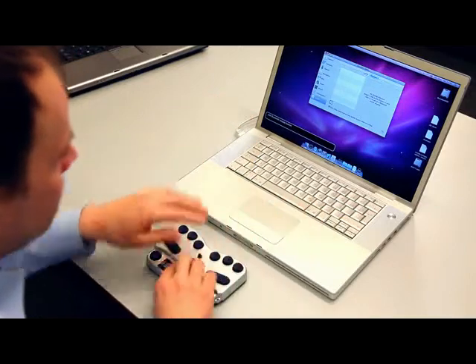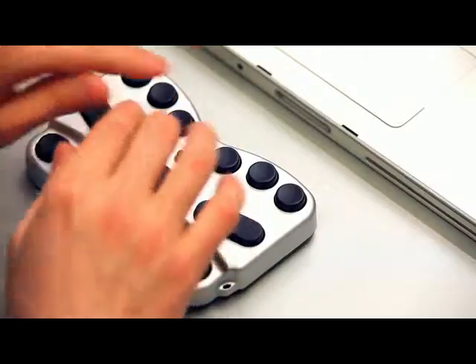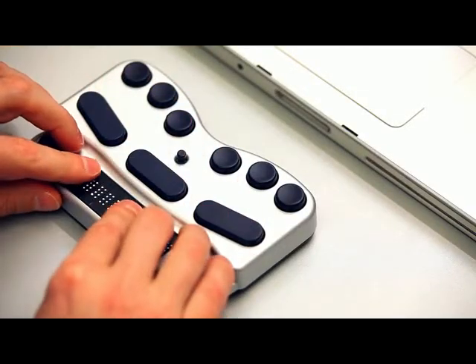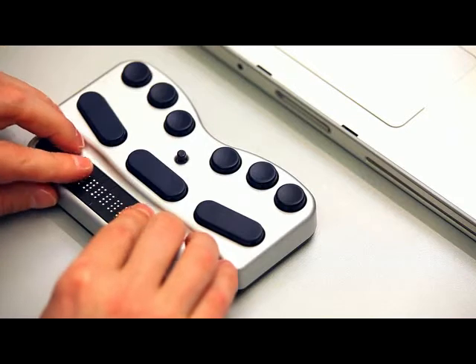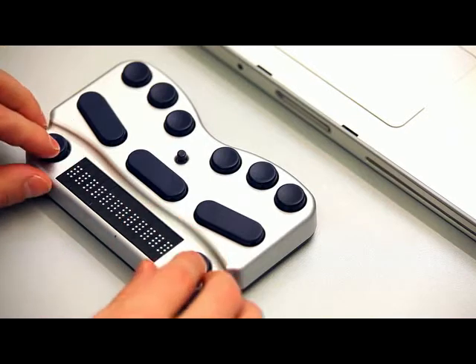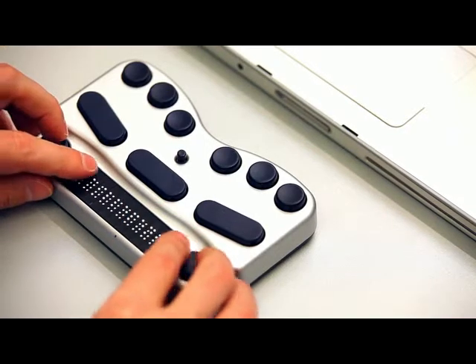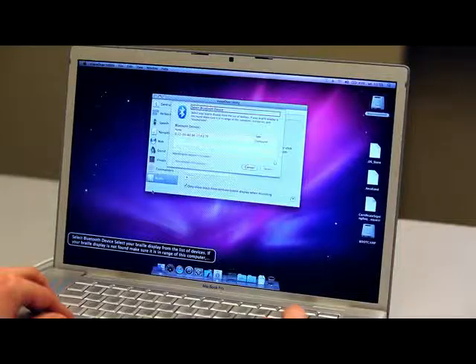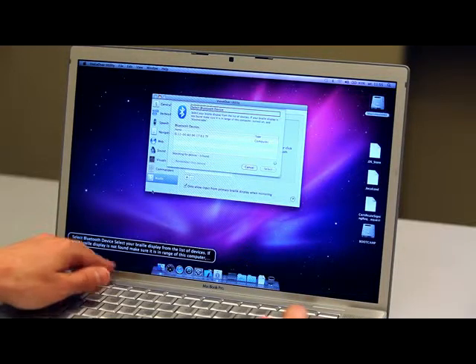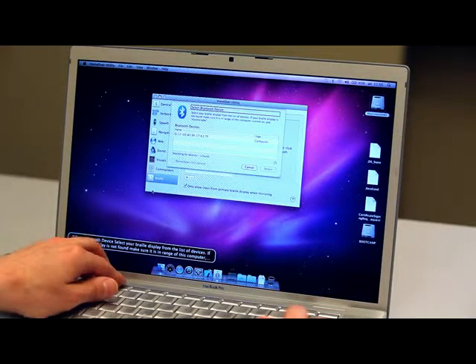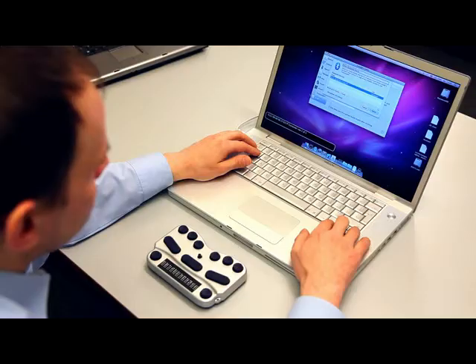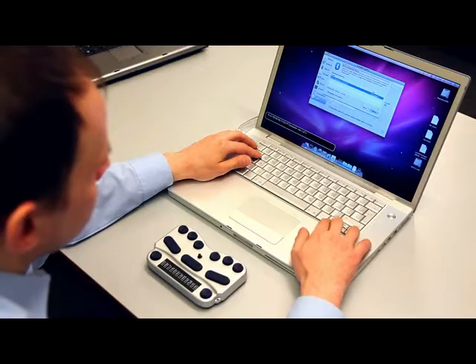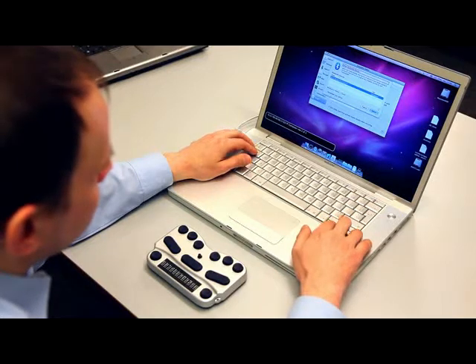Now it's time to turn on the Braille Pen 12. When the Mac finds the Braille Pen 12, it will say 'One row added' or more rows if it finds more devices.